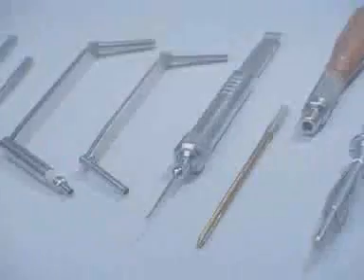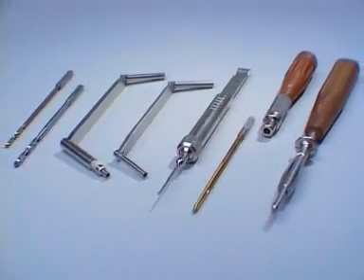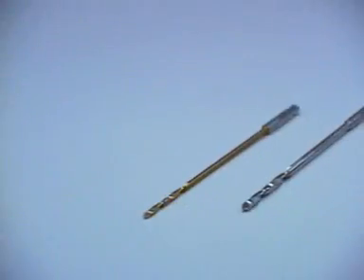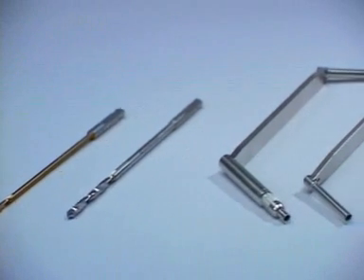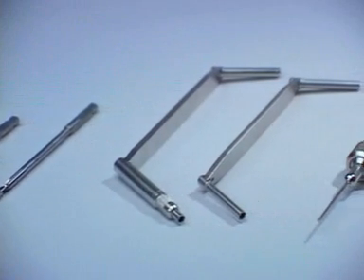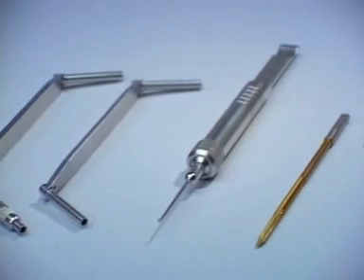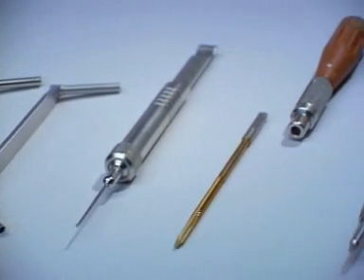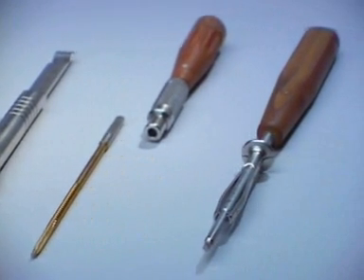To apply the LCP to the radius in the conventional way, the following instruments are used: the 2.5 and 3.5-millimeter drill bits, the 3.5 universal drill guide, the 3.5–2.5 double drill guide, the depth gauge, the 3.5-millimeter tap and handle, and the small hexagonal screwdriver with holding sleeve.